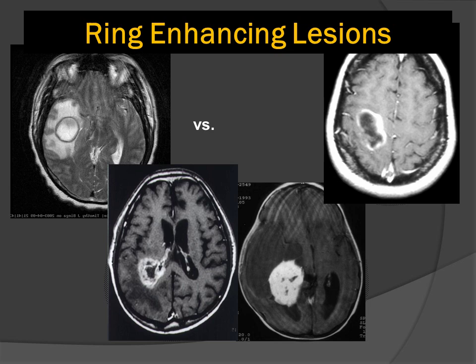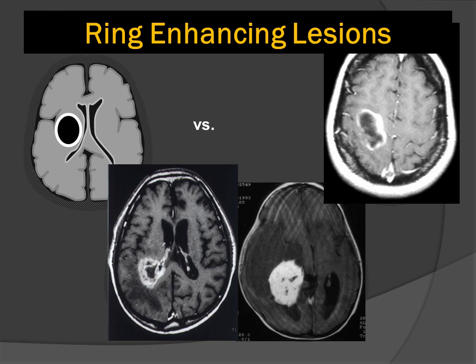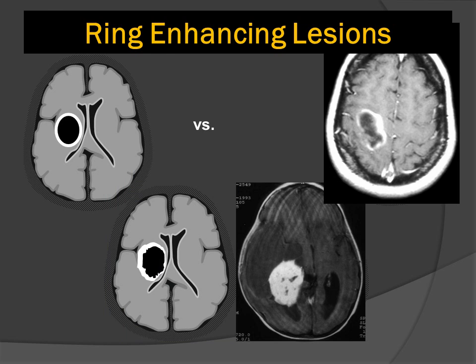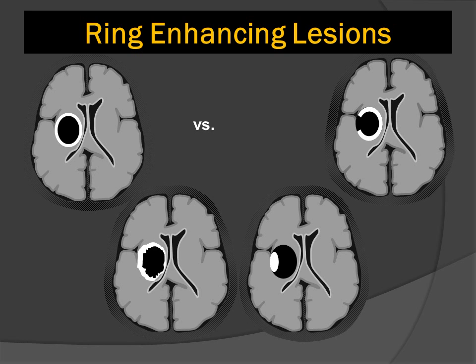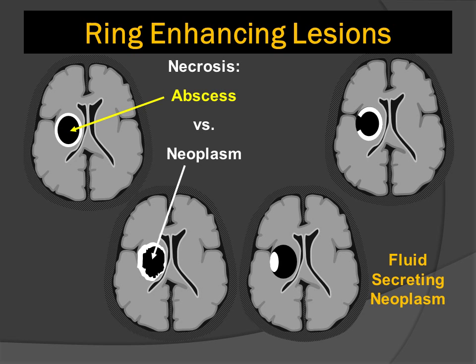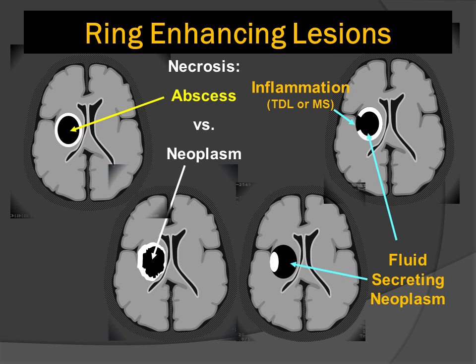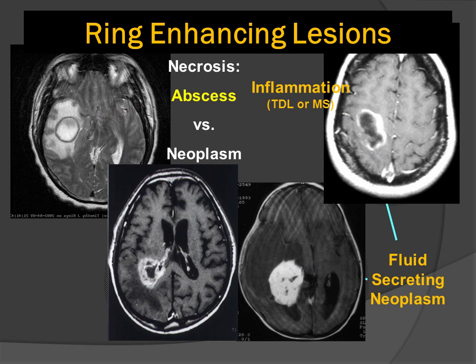When examining ring-enhancing lesions, we look for these characteristic patterns: round and smooth for an abscess; shaggy inner margin and thick wall for a necrotic neoplasm; an incomplete or non-enhancing rim for a fluid-secreting tumor; and a partial rim of enhancement in tumefactive demyelinating lesions. Abscess, neoplasm with necrosis, fluid-secreting tumor, and tumefactive demyelination can all have a characteristic pattern of enhancement.